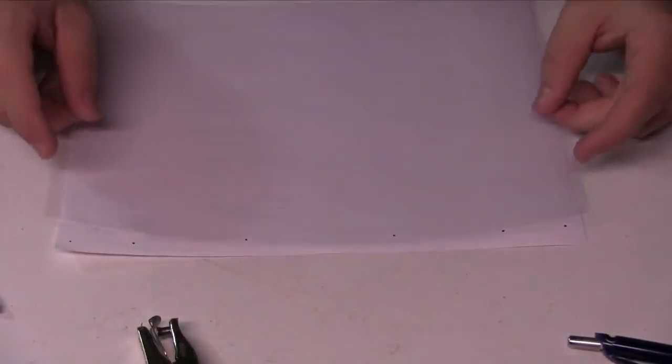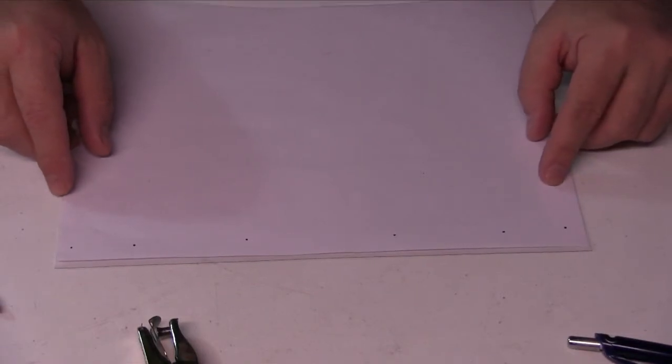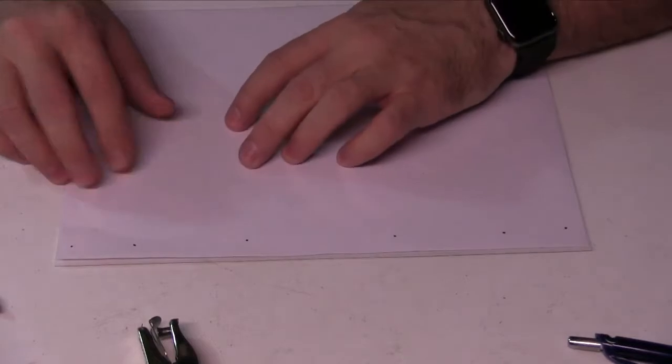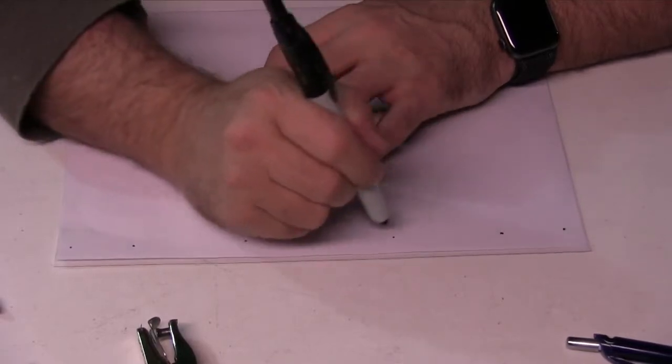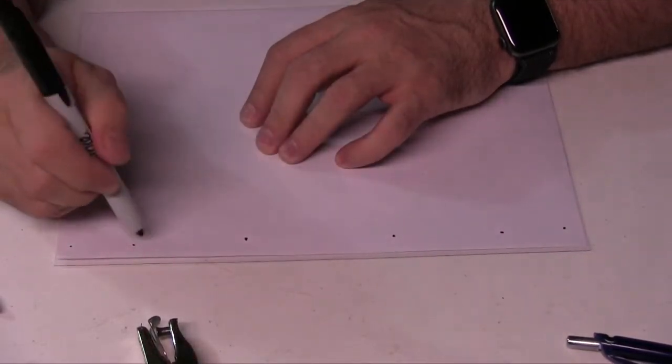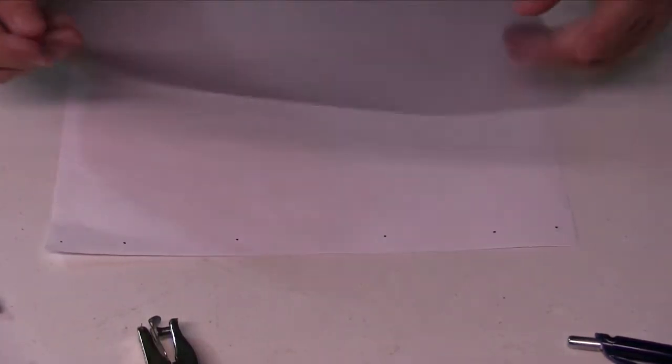Now this is going to be useful because I can then take my plastic sheet that's clear, and maybe give myself some even more space here, and I can take the same marker, and now I'm making markings on the plastic sheet. So now, I don't know if you'll be able to see this, but the plastic sheet has those holes on them. And I can save this template every time I need to make a plastic sheet. I can make the marks on this.